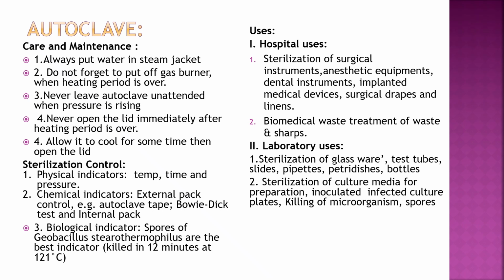Sterilization control: physical conditions like temperature, time and pressure, and chemical indicators like external pack control, that is autoclave tape, or Bowie-Dick test, or internal pack.